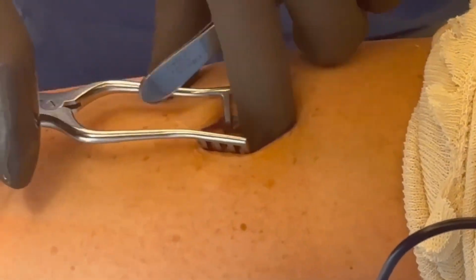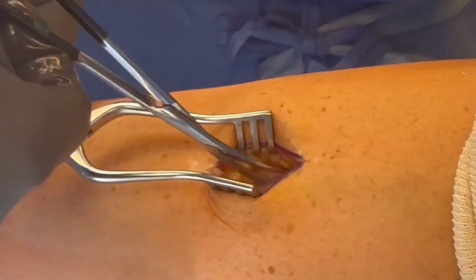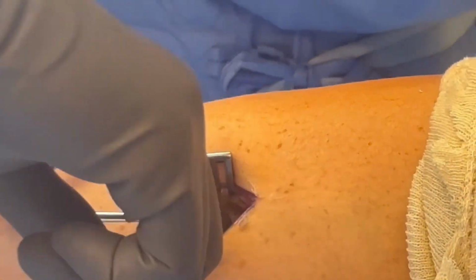Then I'll use my finger to get down to the deep fascia. And sometimes you can feel the saphenous nerve. It'll be on the deep fascia. If you feel it, you can just push it up. The great saphenous vein should be between the tibia and the incision, but if you see it, you can retract it.